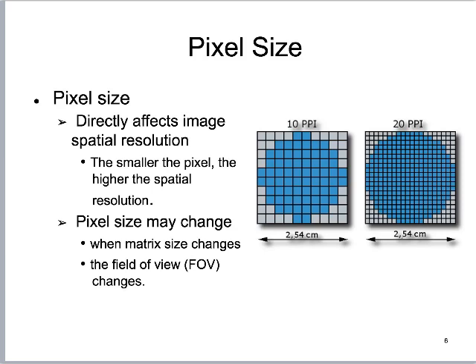Yes? This is the part that has me confused. I understand the more pixels we have, the better the picture because they're smaller. So when you talk about magnification, that's what the picture on the left, you're going to have. Good. The question is, which of these would be the magnified image?